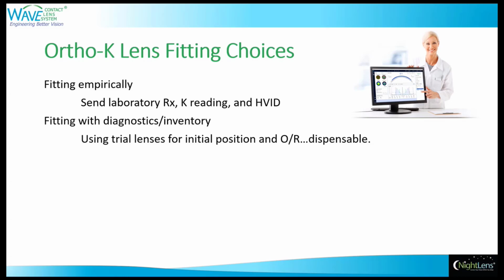In other words, how do I store them properly? Well, if you continue to store them wet, you will need to replace that solution in the vials periodically. But if you decide to store them dry, then before the patient comes in, you're going to have to take certain lenses out of the inventory and store them wet for at least 4 hours in order for them to be halfway comfortable when you insert them in the eye.